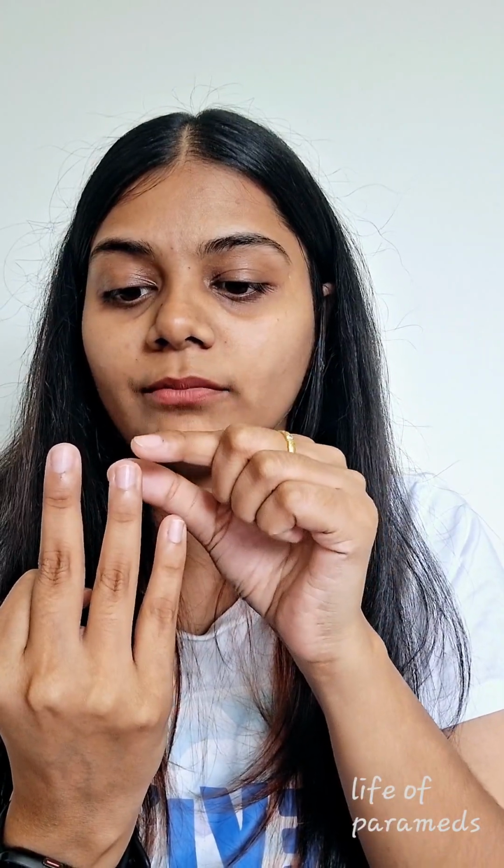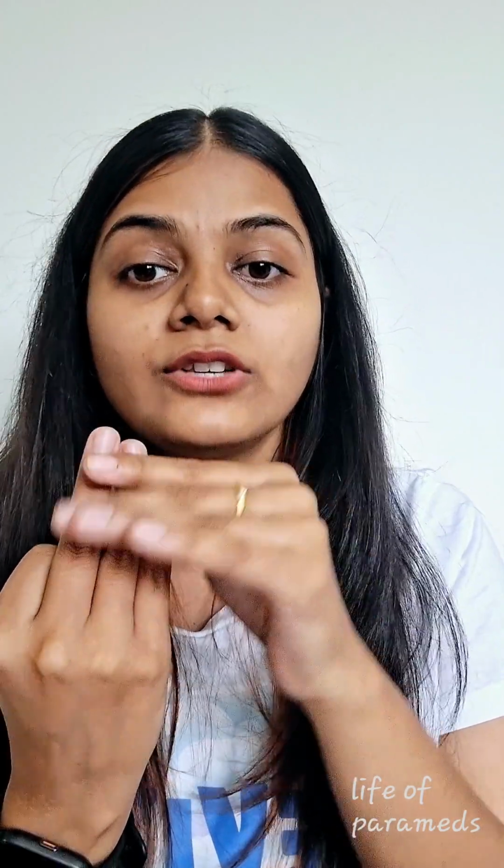The placement of oxygen in the flow meter: the first gas is air, then nitrous oxide, then oxygen. So oxygen is the third one. This will have less leak because oxygen is directly connected near to your oxygen supply. If oxygen were your first gas, it would leak from here also, and here also. So oxygen should be the last gas to enter into the rotameter.